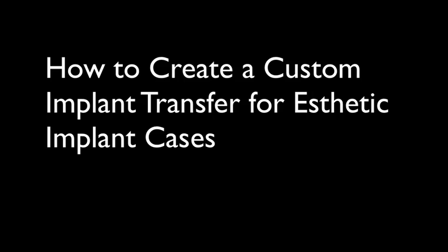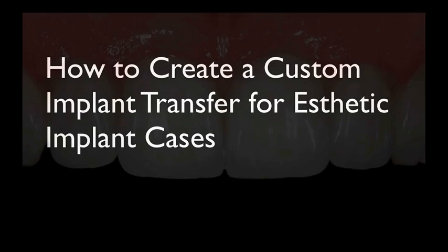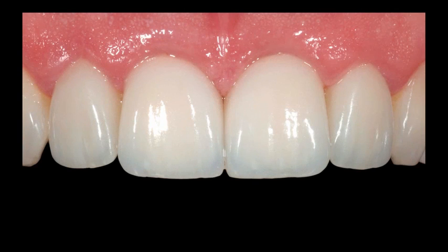This is an exclusive video for the dentists that have joined our mailing list at phelandentalseminars.com. The video is called How to Create a Custom Implant Transfer for Aesthetic Implant Cases. Basically the whole point of this video is to achieve an excellent gingival outline form and gingival architecture around your implant cases. This is a case that I treated about 5 years ago that I'm going to use to illustrate the techniques that I'm going to talk about in this video.